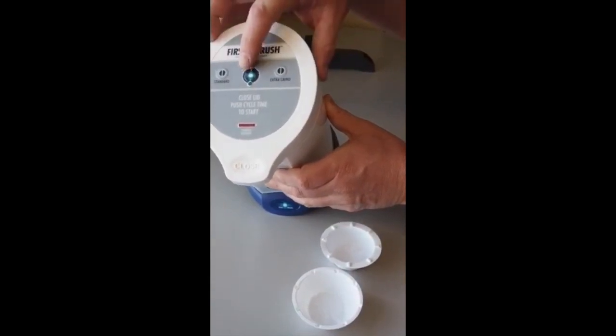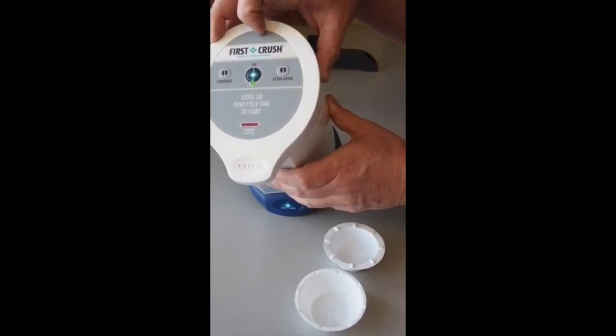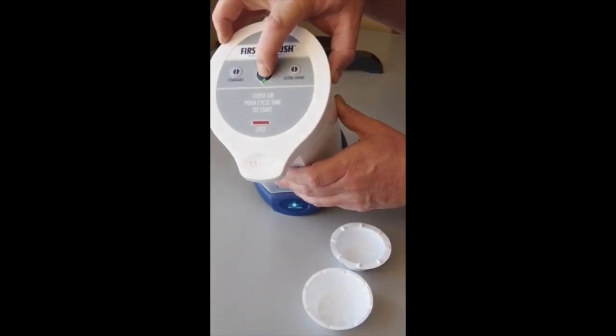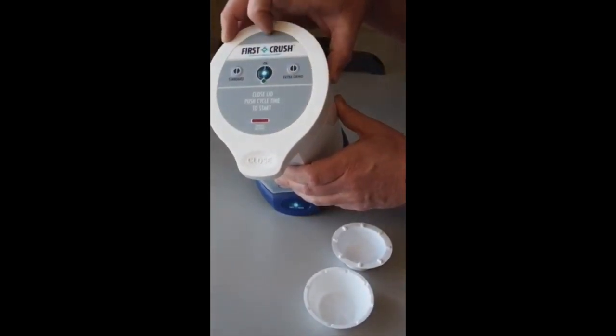To turn on the unit, you simply press the blue on button in the middle of the keypad and the small green LED will turn on. You can hold down the button for several seconds to turn it off, or the unit will turn itself off after about 5 minutes of not being used to conserve battery life.